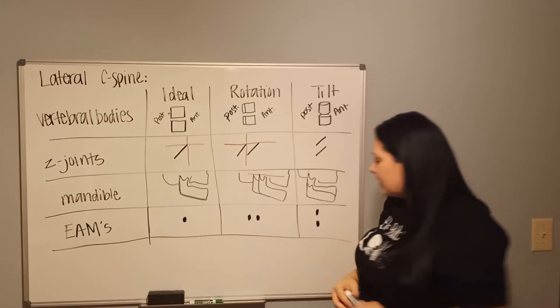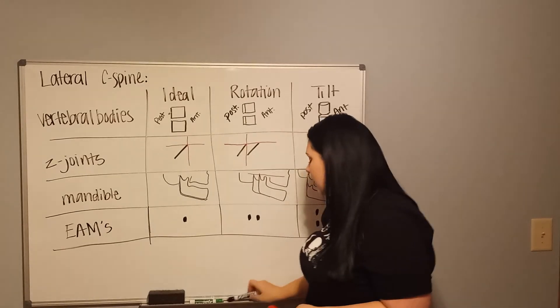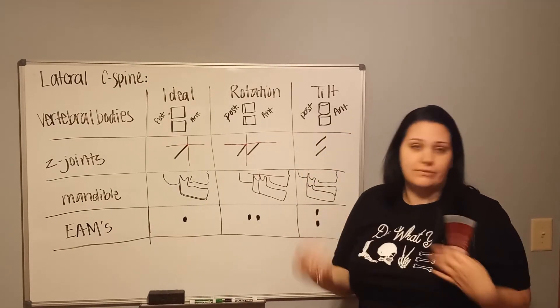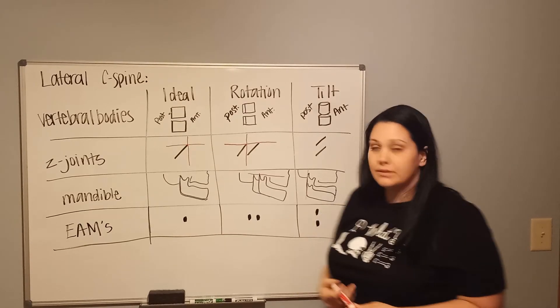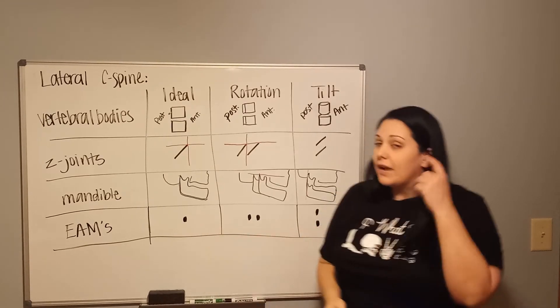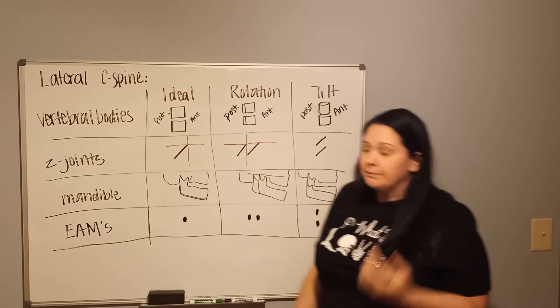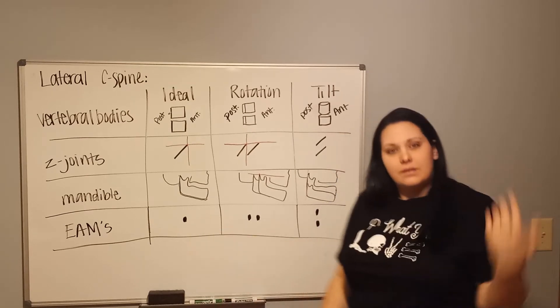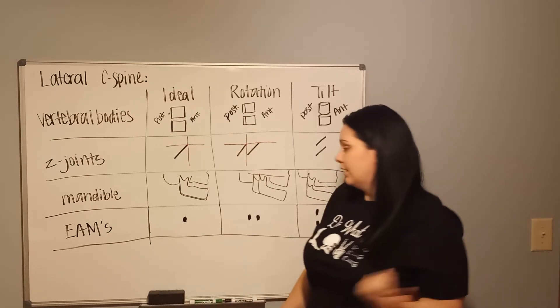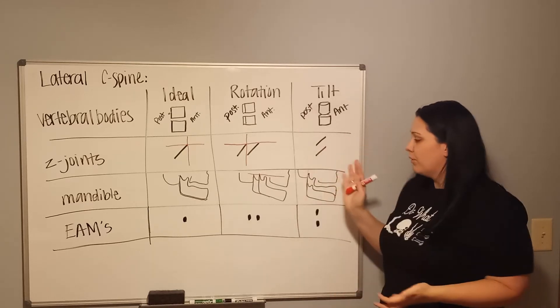Then again, the last thing that you can look at, if it's visualized because of your technical settings, is your EAMs or your external acoustic meatuses. They should be, again, essentially superimposed. Same concept as the rest of this board.